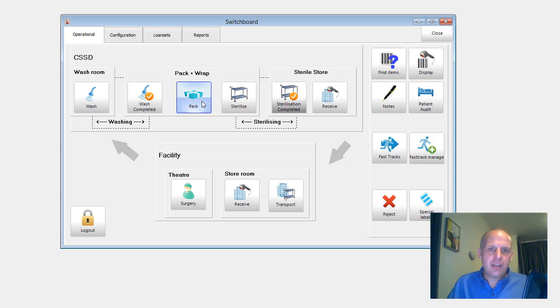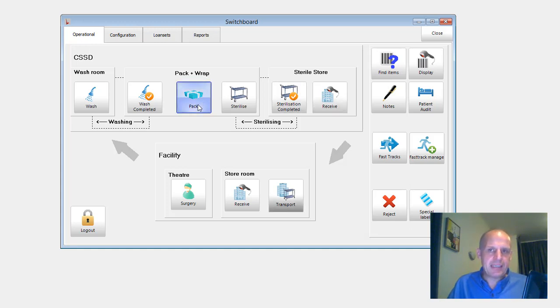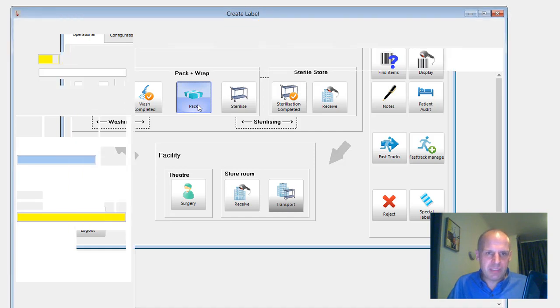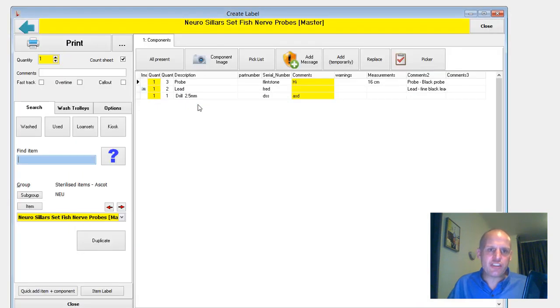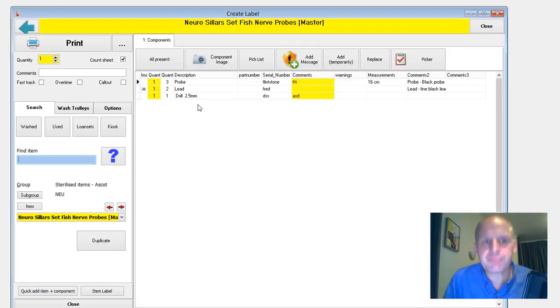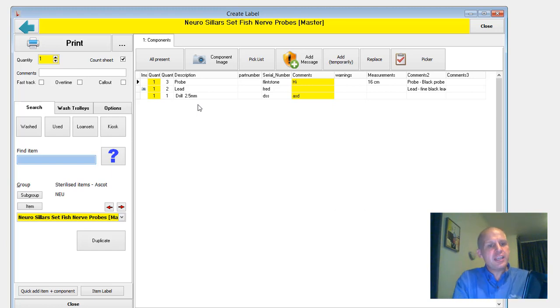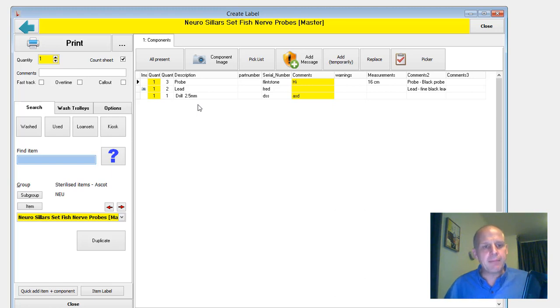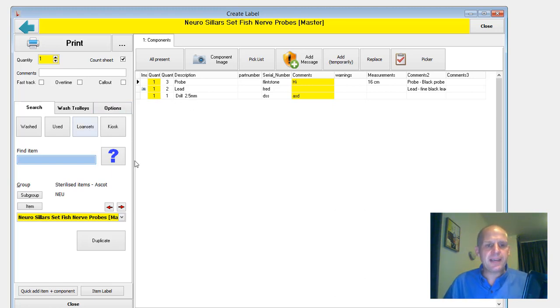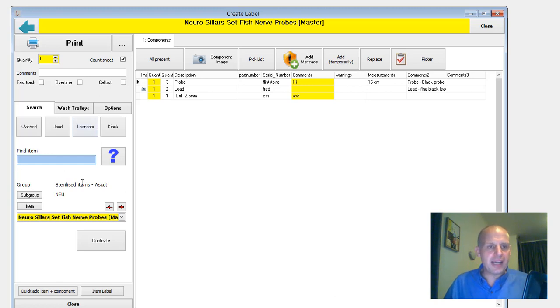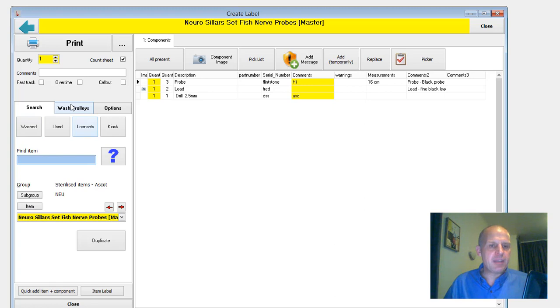Now, here's the big change. The pack screen, its layout has changed significantly. And it will take a little bit of time for experienced users to get used to it. The big, big change is the fact that I've moved all the search capabilities onto a tab here. So you can search by this.